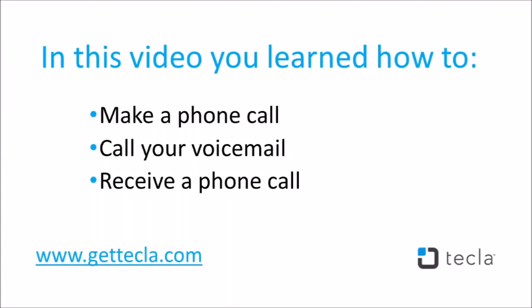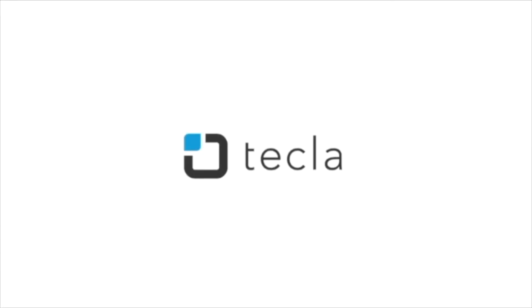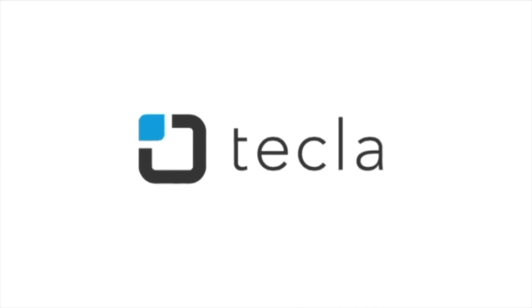In this video, you learned how to make a phone call, call your voicemail, and receive a phone call. Now you are ready to start making and receiving phone calls using Tecla E. For additional settings or recommended configurations, please visit our support page at gettecla.com.